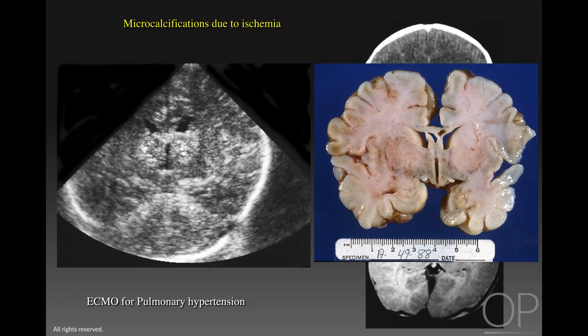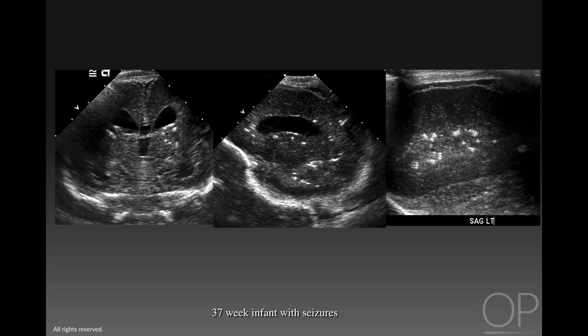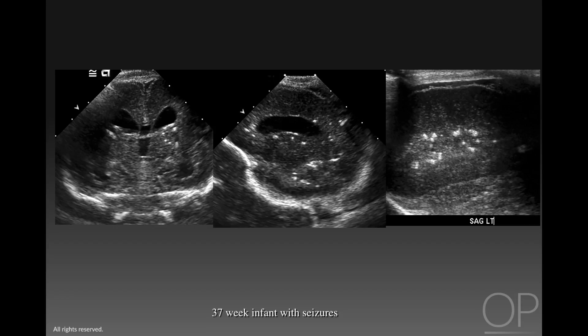The other pattern of calcifications is seen in this child who is 37 weeks and presents with seizures. In addition to multiple coarse calcifications in the periventricular white matter, this infant has very limited sulcation despite being near term. This child had been infected with cytomegalovirus during pregnancy, and these focal calcifications represent secondary granuloma formation from the CMV infection.